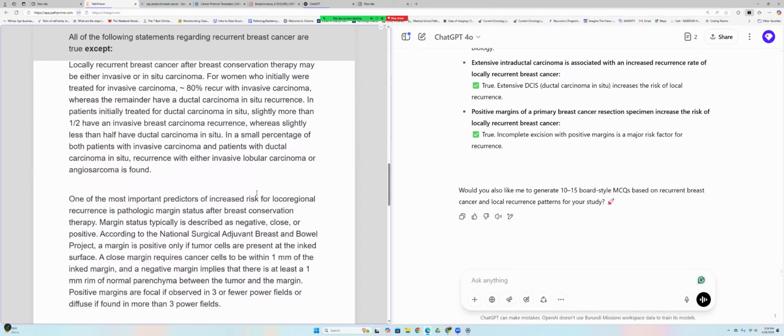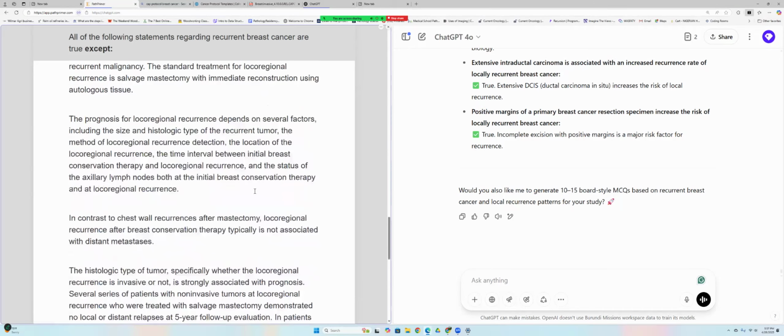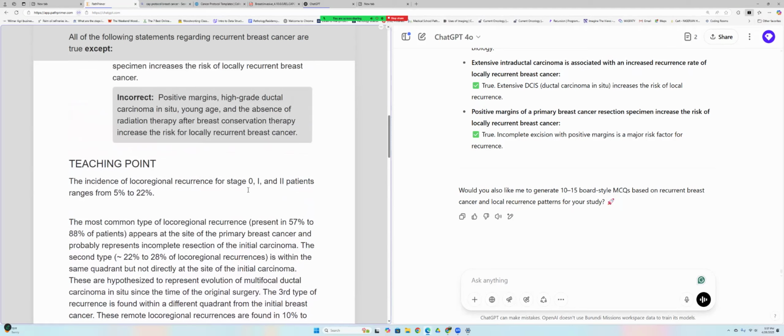Okay. Do you want to read through this, or is it very long? Or should we just go ahead to review it immediately? Just glance. Okay.